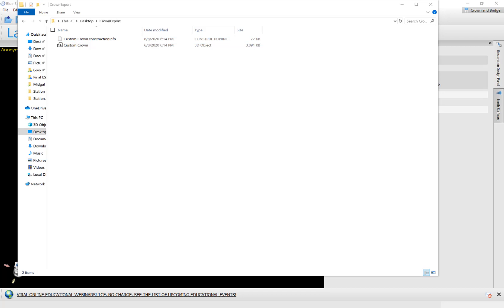As I said initially, this functionality of designing the crowns and exporting the STL file and the construction file, these are free functionalities and they are going to stay free for quite a while. So go ahead and enjoy. Create as many crowns as you like. Design them. Export them. Mill them. Have a great time. Thank you very much.